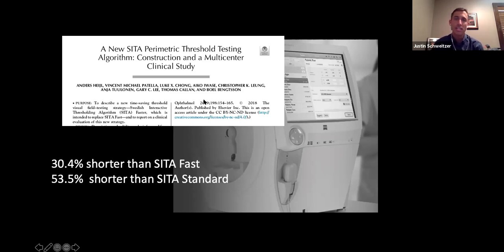And then you have your screening tools out there also. FDT is a good screening visual field, not ideal, in my opinion, for long-term management of glaucoma patients, but an excellent screening tool to use in a practice where maybe you're running patients through a pre-testing area. So excellent question.